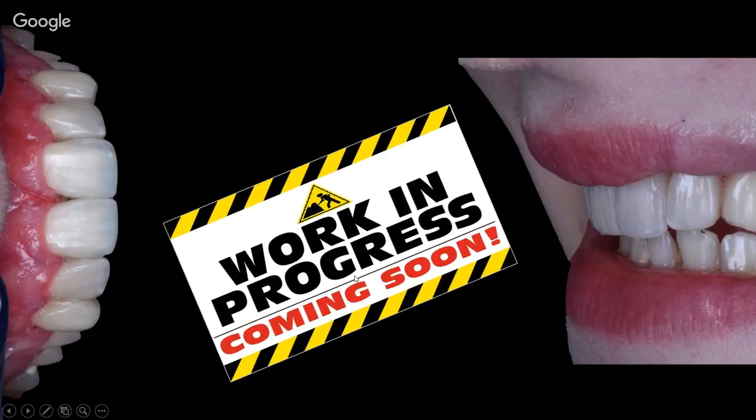I know they are very tiny things, and the patient is super happy, but why not make it as best as we can? So I'm just waiting for the healing of the soft tissue, and this healing is going to be very fast, because I've been super clean and super smooth when I worked close to the gingiva. So pretty soon I can show you the final result of this case.